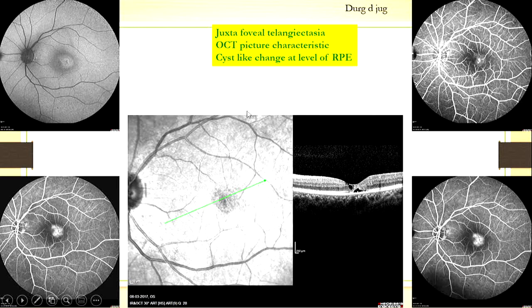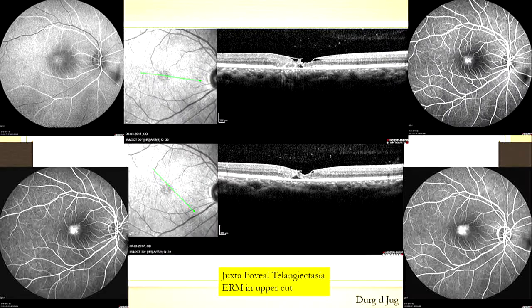This is a patient with juxtafoveal telangiectasia. What you see here — these cysts, normal foveal contour — these are actually degenerative cysts. These are degeneration of the Müller cells which is causing this. And this does not need treatment. This is not a treatable situation.